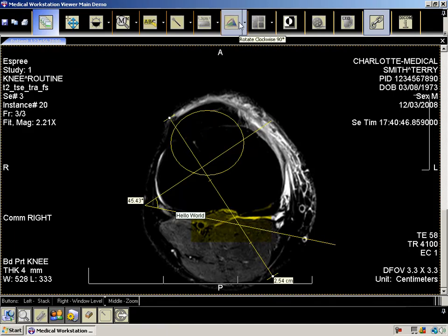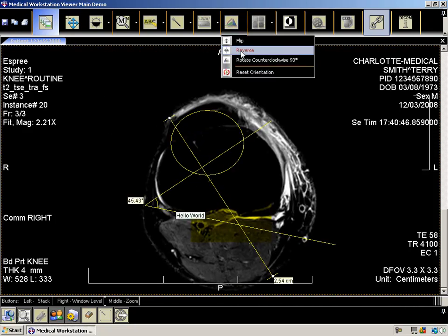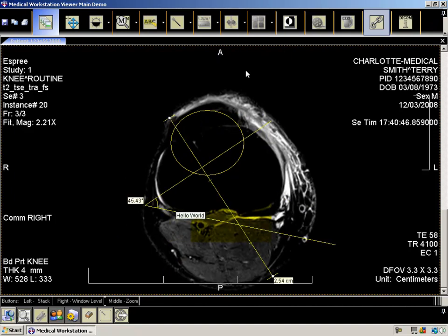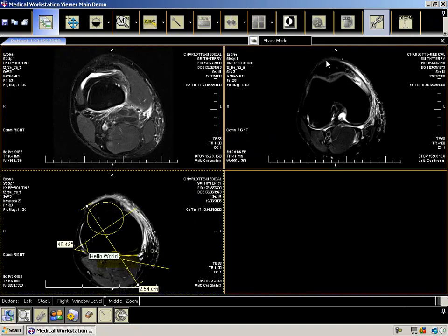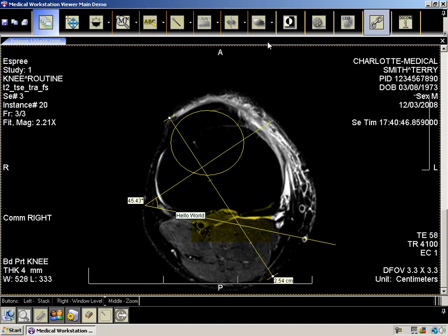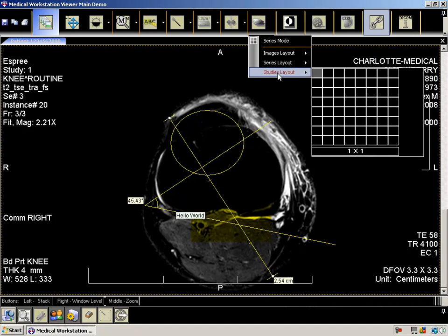The next button allows you to perform some basic image rotation and also lets you reset the orientation. The series and stack modes allow you to switch between viewing the images as three separate images or as a stack of images. Use the drop-down to change the layout of the images. You can then switch back to stack mode. You can change the number of images, series, and studies displayed at one time.